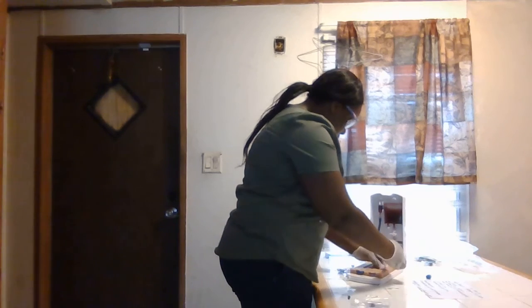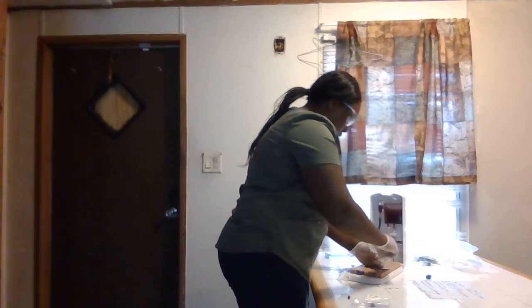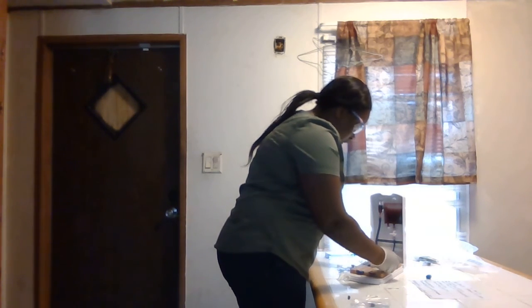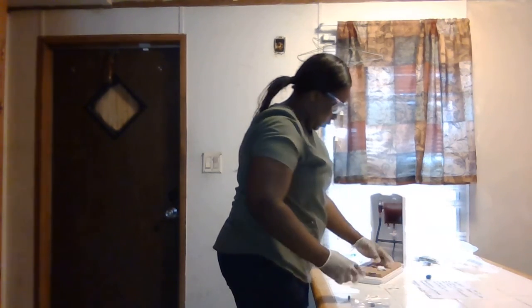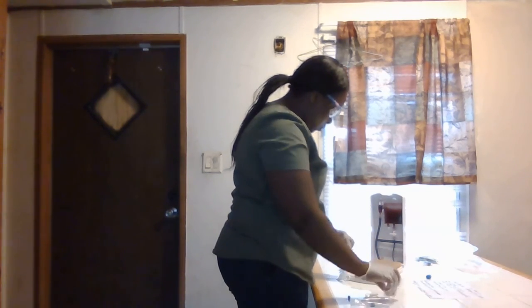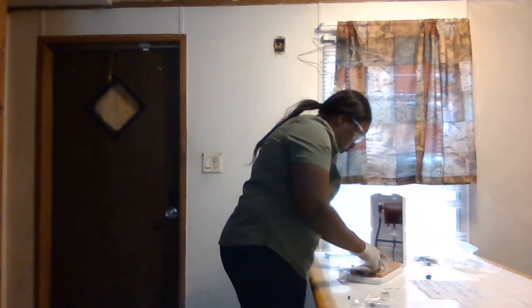Okay, the bleeding stopped. I'm going to put a new gauze on here, still holding pressure, and tape it down with my tape. I'm going to apply my pressure dressing. All right, and I always assess my site. Make sure there isn't any redness, edema, or hematoma.